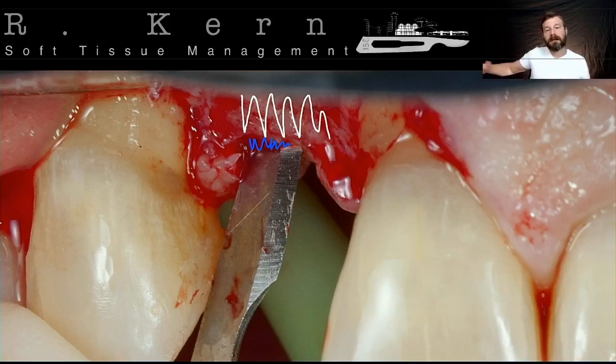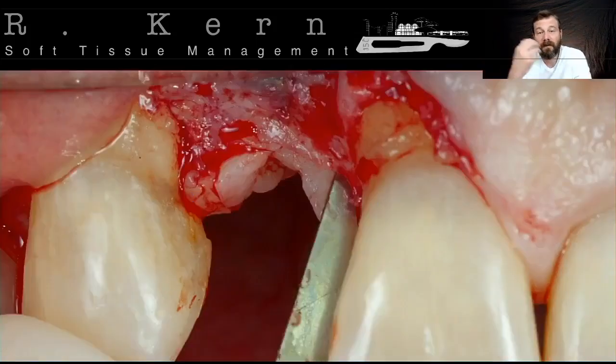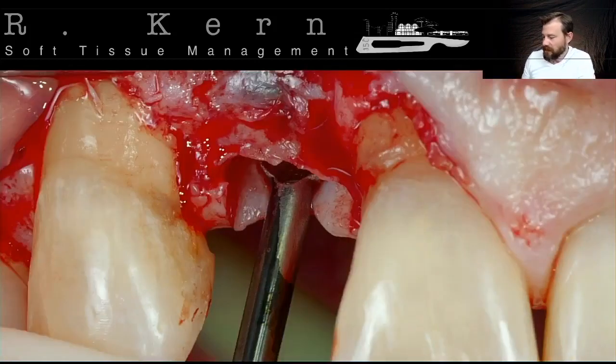When I rotate, my pediculum is going to be on the top of this layer here. If I remove this layer, the pediculum is going to be more apical, and I really need to bring all the thickness necessary to rebuild a great amount of tissue for this defect. Okay, so this is another tip.